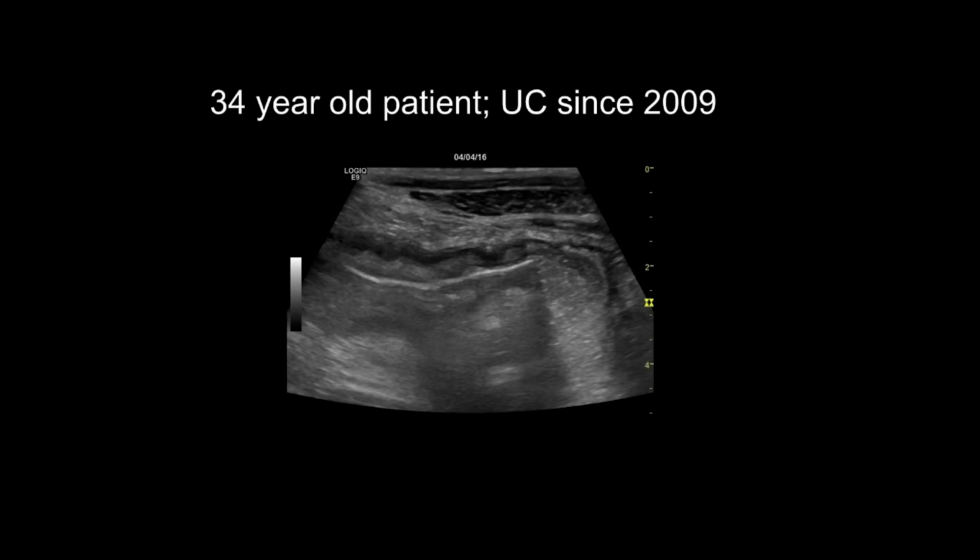But if you look at the video image, I'll start that, and you clearly look, the bowel wall layers actually look a bit different. You see the muscularis area is thickened. It's more the outer layers that are darkish and thickened, and that actually was a lymphoma in the ascending colon.